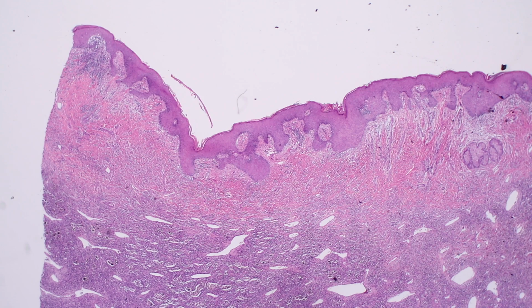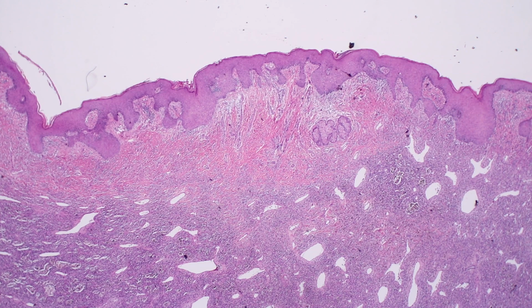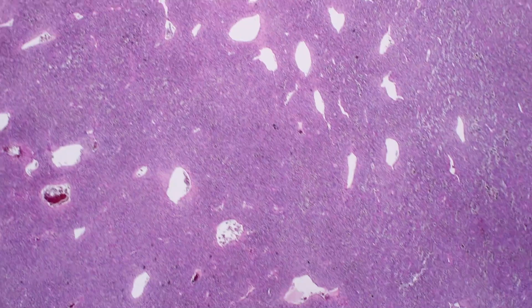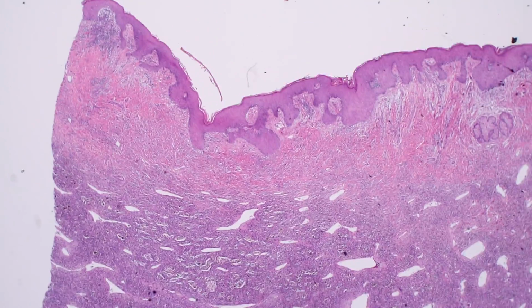It was excised initially, I think, because there wasn't certainty clinically. They weren't sure what it was, and they were worried about it because it was a large mass on the leg of a young woman. You can see that the typical features of dermatofibroma are here, but it's easy to overlook all that because you're like, what in the world is this huge cellular thing in the dermis? But let's look at those first, and then we'll go look at the cellular areas.